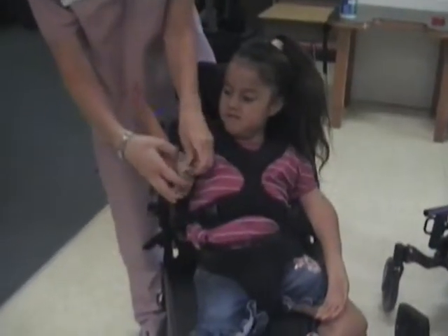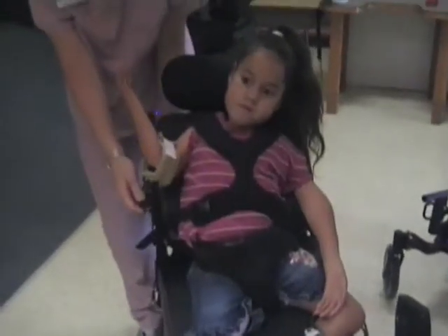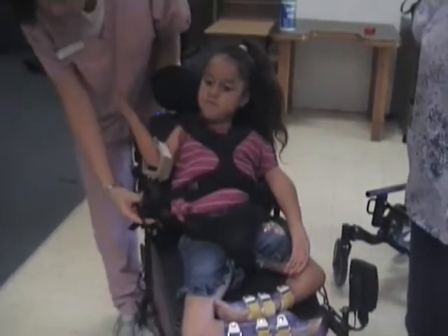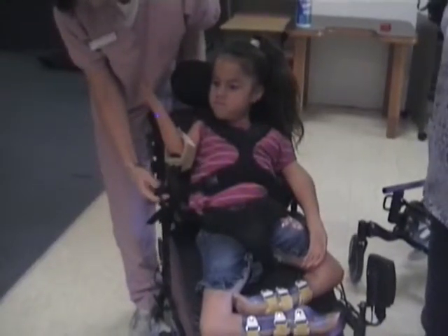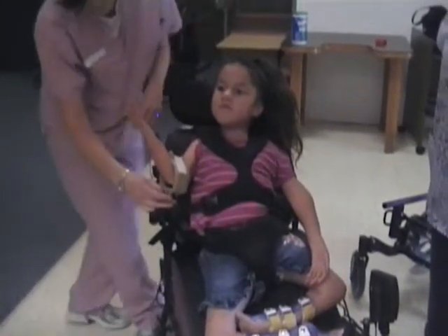Ariana's power chair is powered by a cup that is fastened to her elbow, so she will learn to drive using her elbow, which is also created by our OT and PT staff — our team.